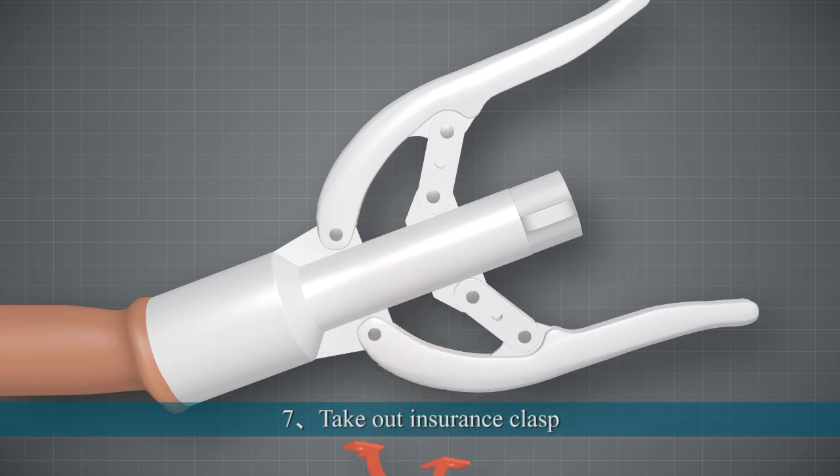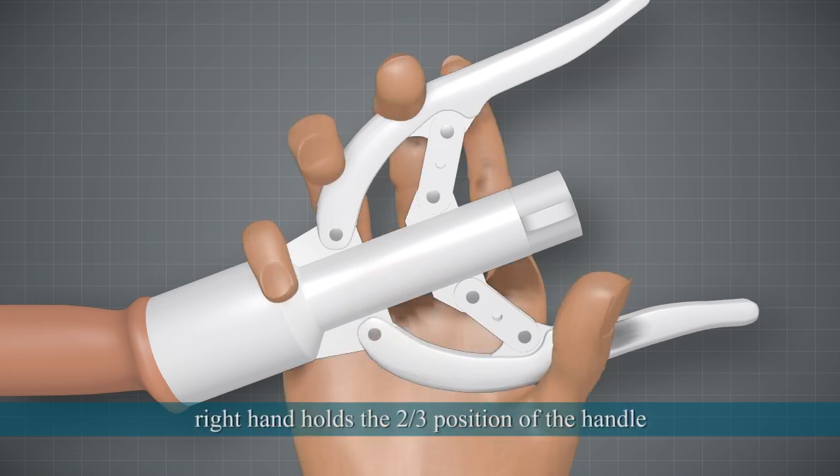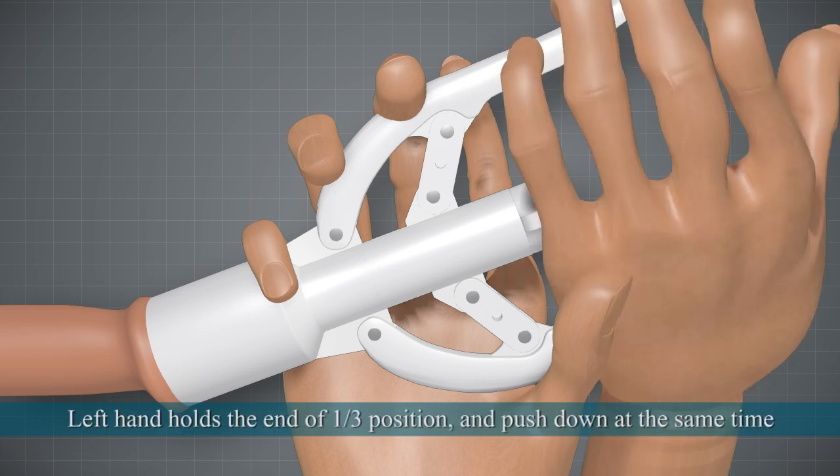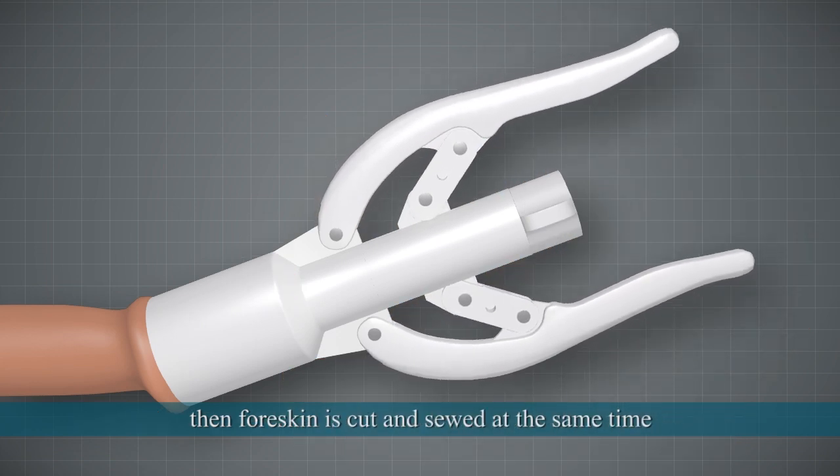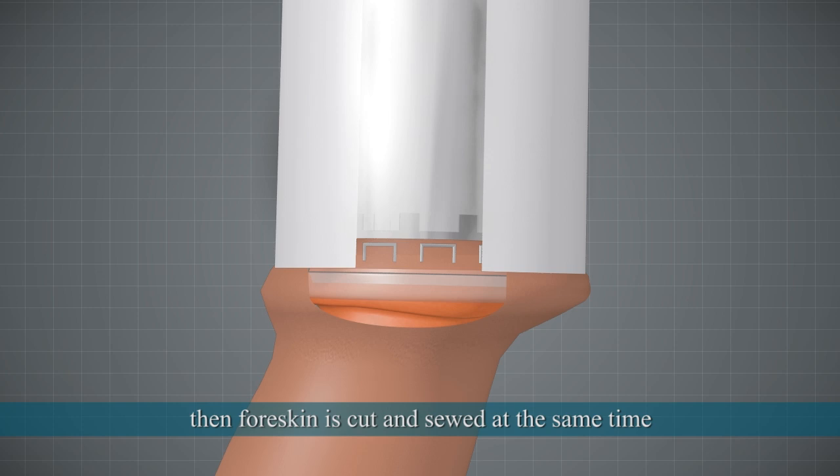7. Take out the Insurance Clasp. The right hand holds the two-thirds position of the handle; the left hand holds the end one-third position and pushes down at the same time. The foreskin is then cut and stapled simultaneously.